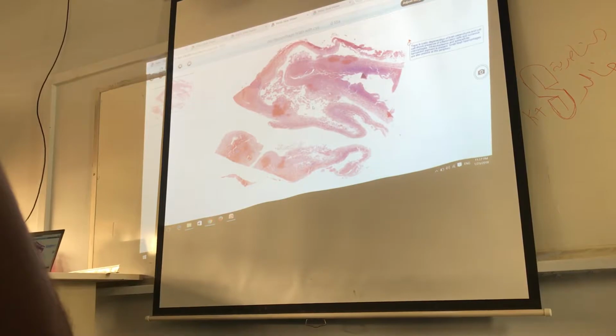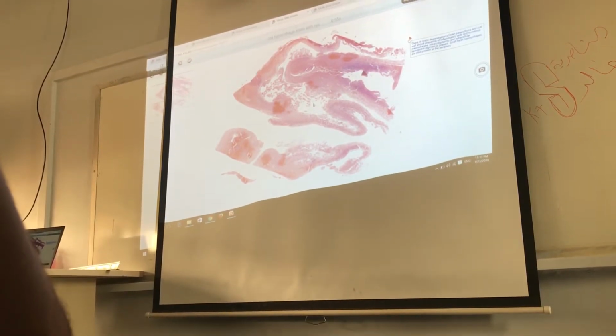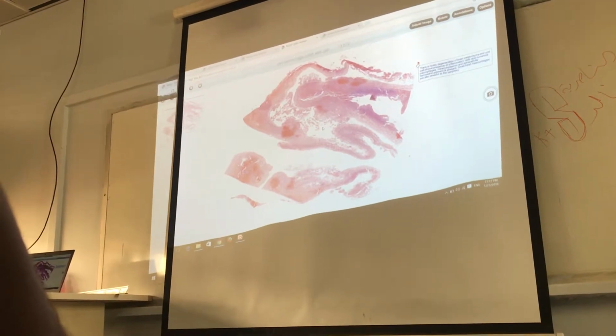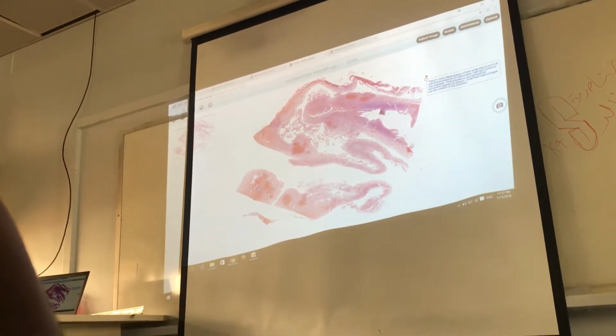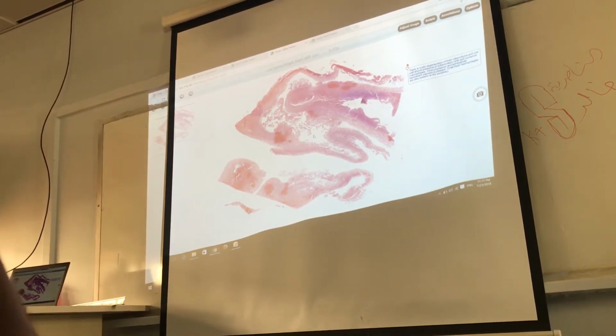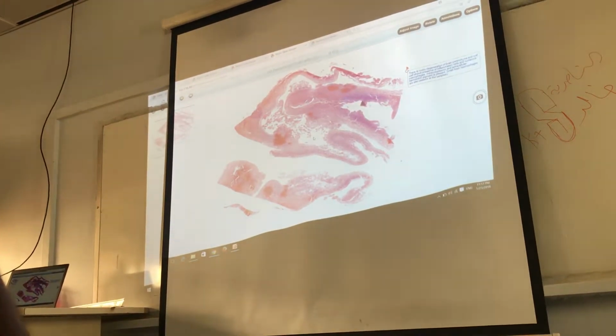What type of infarct does it have? Liquefied necrosis, but infarct. The infarct is cystic. The loss of these neurons creates a space. Yes, this is what we are seeing here. A space is created. So this is a cystic infarct.